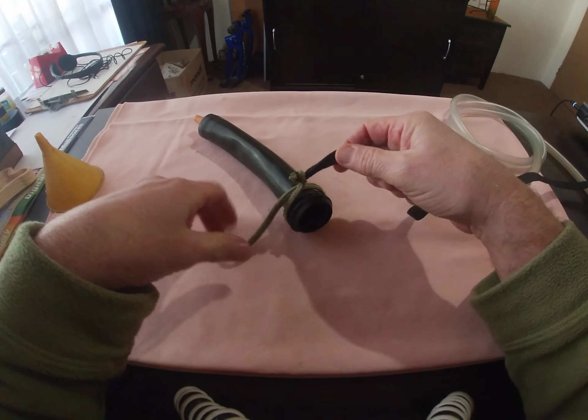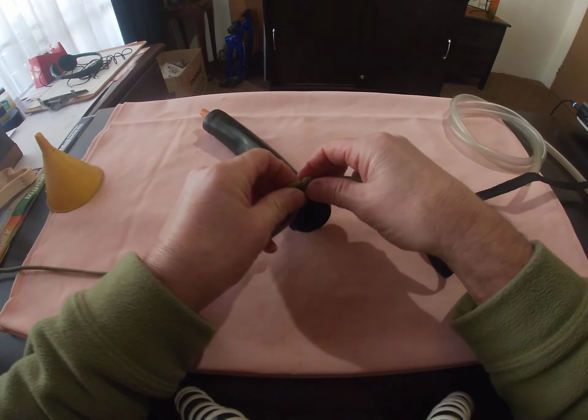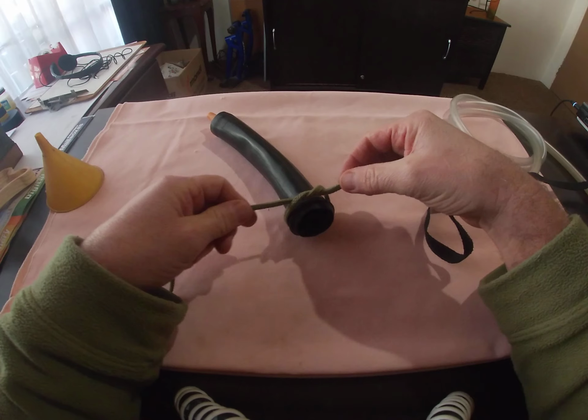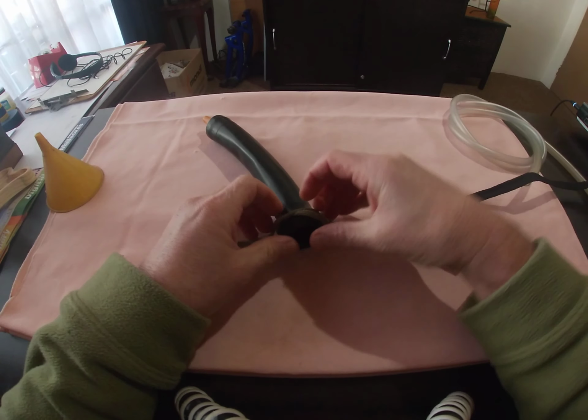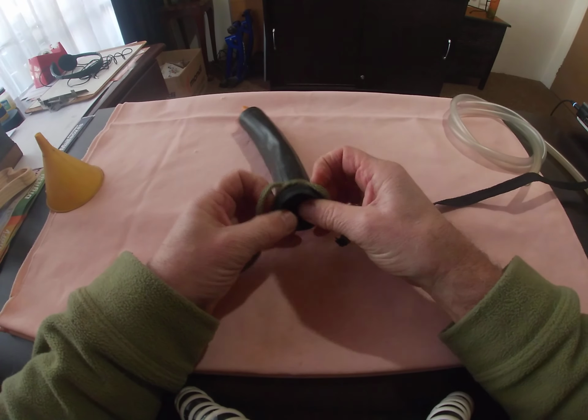I'm not gonna loop it twice like I did, but you will have to find a way. I'm just gonna show you. Once you pull it tight, that knot stays behind.